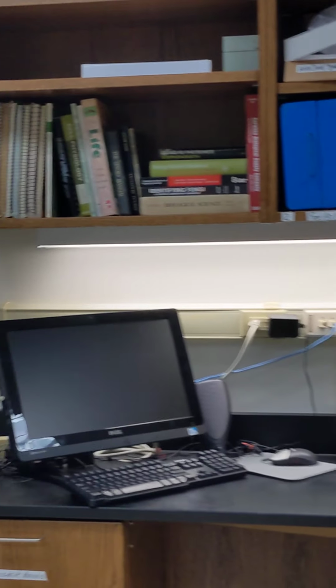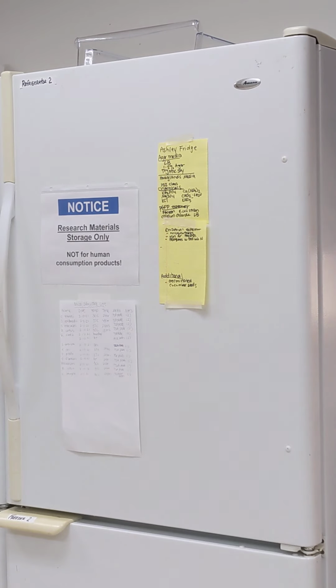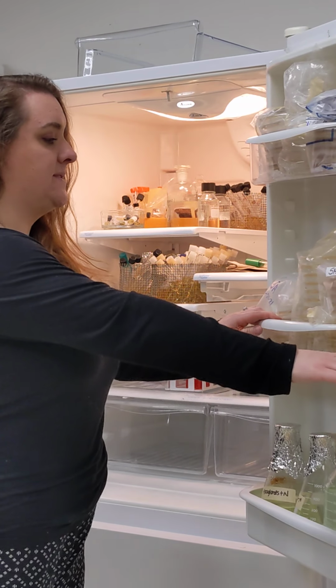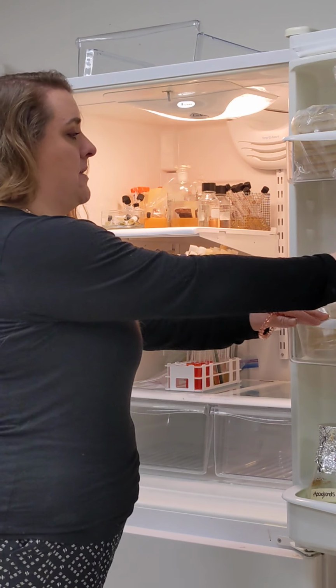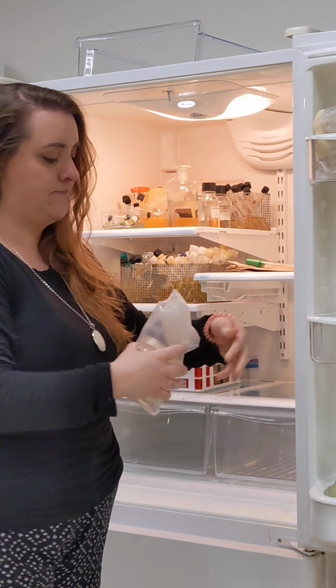So I'm going to direct us over to the fridge here. I'm going to grab out a handful of things that I tend to have on hand for lab. One of the things I tend to have quite a bit of are some different types of solid plate media, for growing some of the different really common microbes. And you'll see in the door here, I've got some different plates that are present.